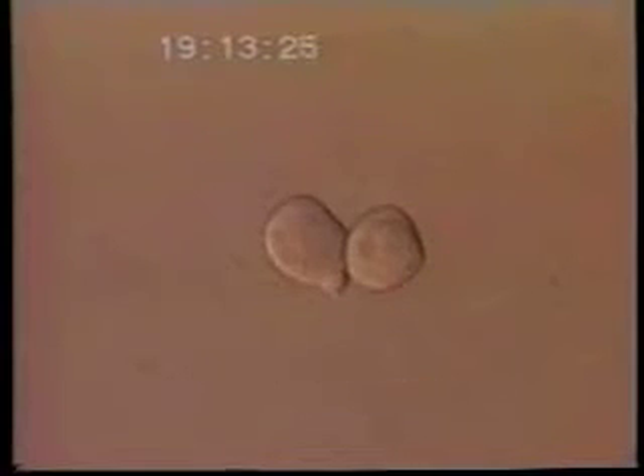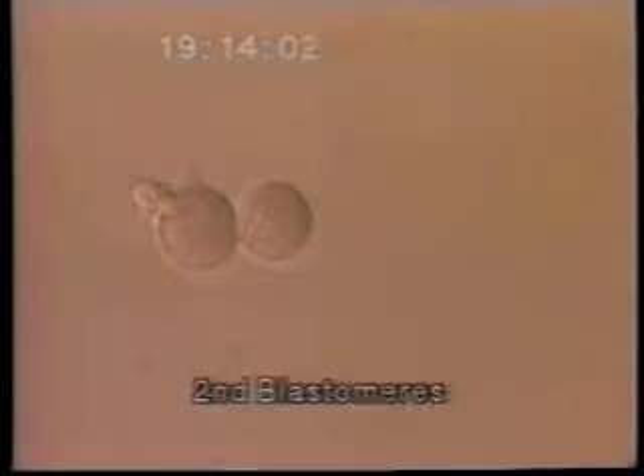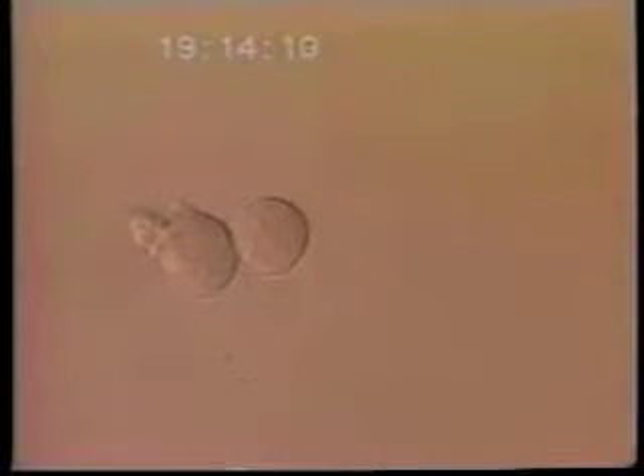Here you see the blastomeres from the first embryo lined up nicely and ready for genetic testing. This is from the second embryo — two beautiful intact cells, each of which is potentially able to develop into a baby — and the single blastomere from the third embryo.